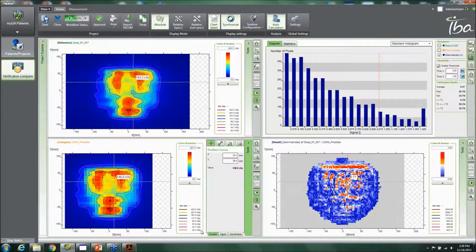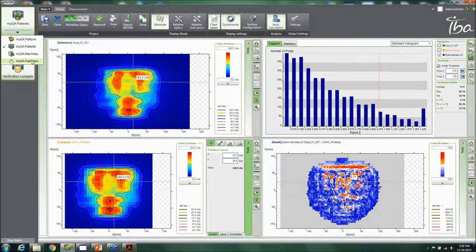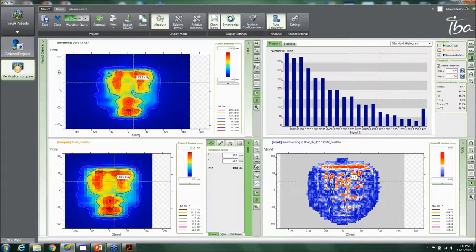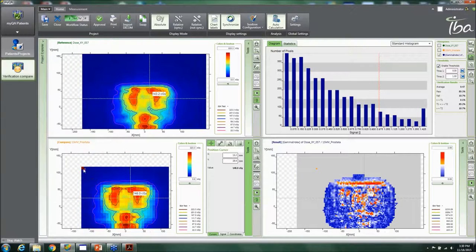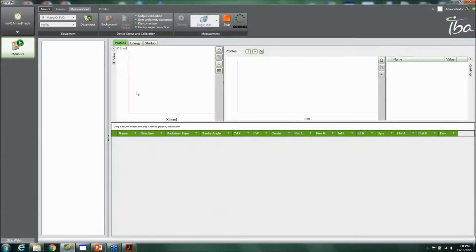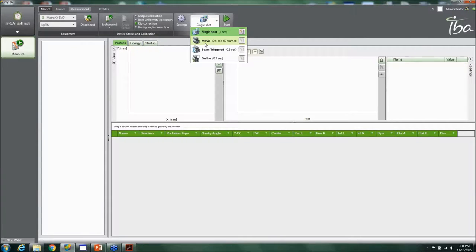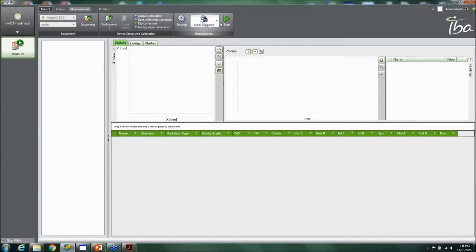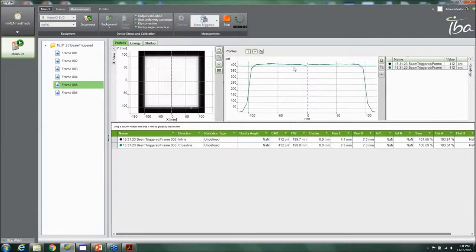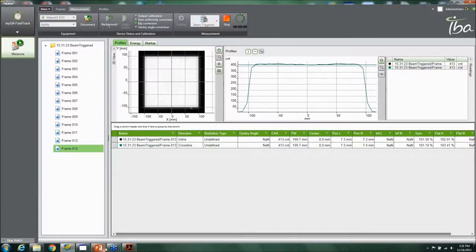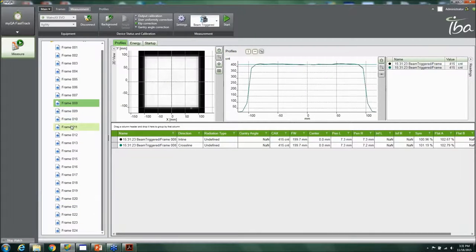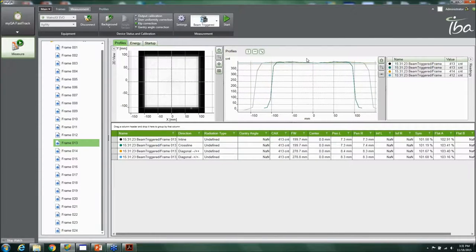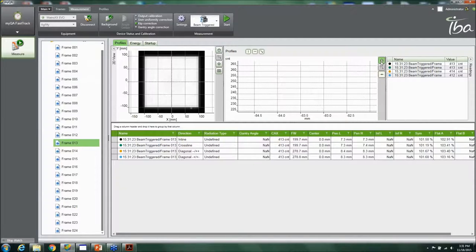If you notice something strange in one of your measurements — for example, a pixel that looks unusual, possibly a malfunctioning detector — you can quickly switch to MyQA Fast Track. This module lets you look at beam profiles and assess flatness and symmetry. Using the same beam trigger mode, you click Start, acquire a profile in real time, then click Stop. You can then look at diagonal and individual detector data to see if there's a drop or something unusual in one of the profiles.